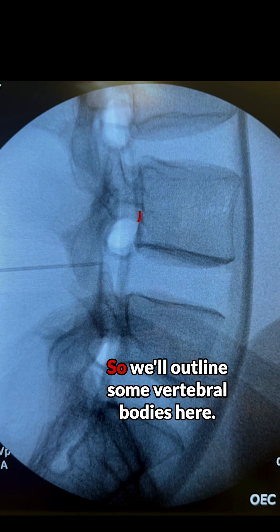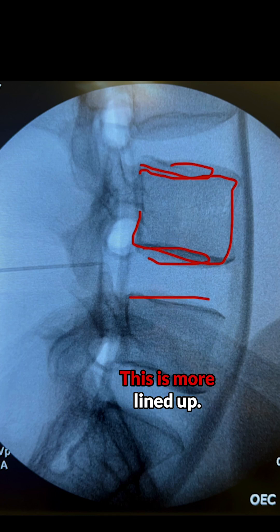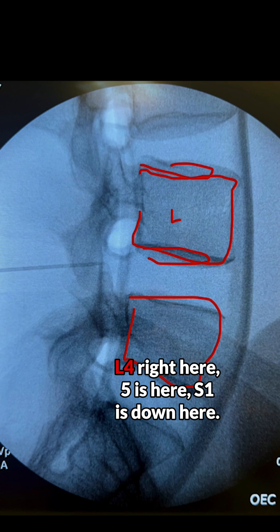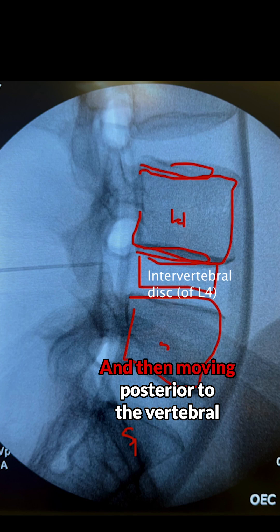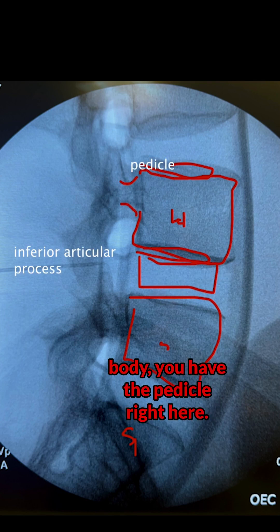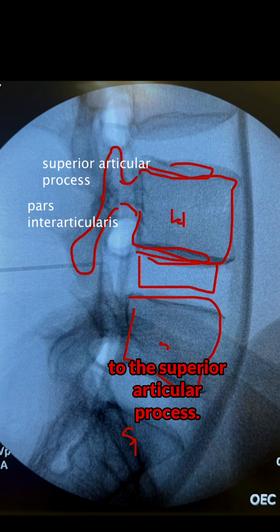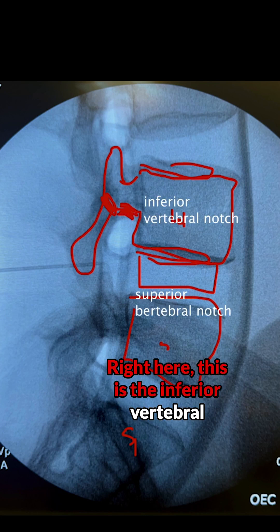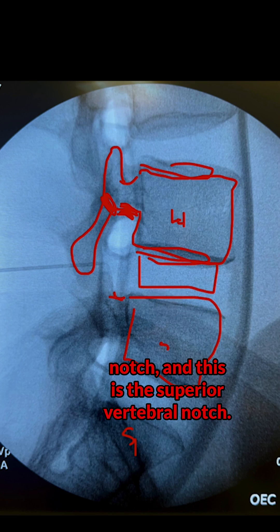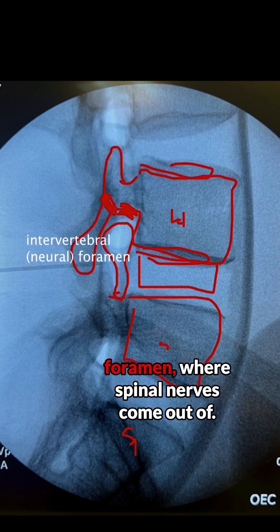Now we'll go over some lumbar anatomy, outlining some vertebral bodies here. This is L5, L4 right here, and S1 is down here. This space right here is the intervertebral disc space. Moving posterior to the vertebral body, you have the pedicle. Coming further down, you have the inferior articular process, then leading up to the superior articular process. The area between those is the pars interarticularis. This is the inferior vertebral notch, and this is the superior vertebral notch. The space in between is the intervertebral foramen or neural foramen, where spinal nerves exit.